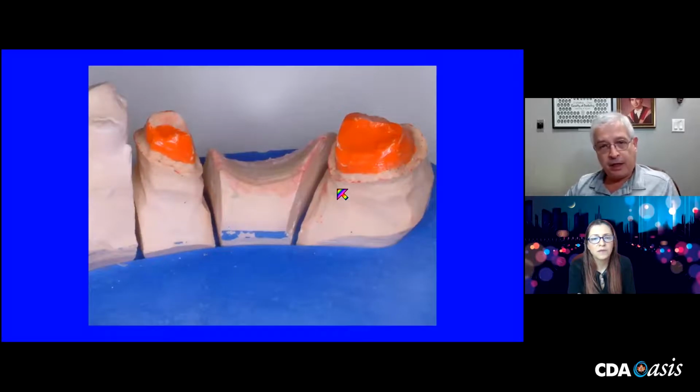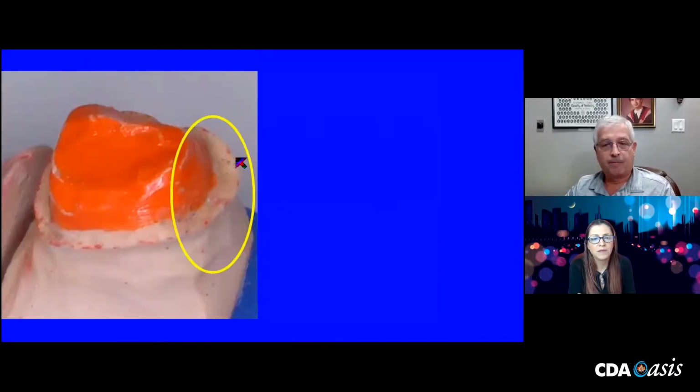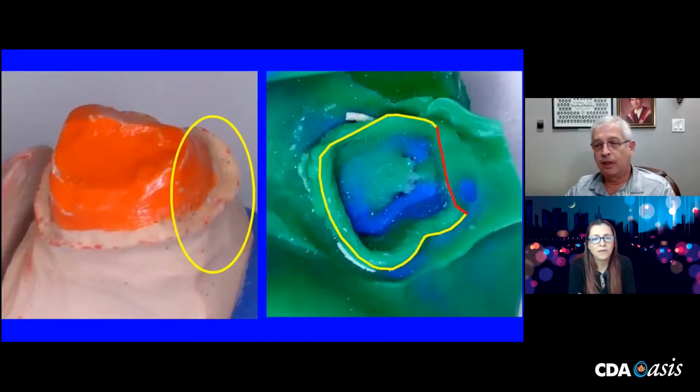Yet, when one goes to the study model, well, there's a nice shoulder here, and there's one here. Again, distal of the molar, and that's the accompanying impression. Well, how did this get here? Because it's not there. So in my mind, a lab technician or somebody had to fudge it. They had to fake it. What would it look like extrapolating from what information do I have here?